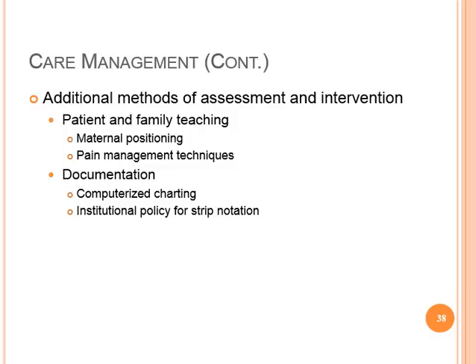It kind of depends. Back in the old days, before we had the computerized system, everything we did to the mom, to the baby, we would chart it on our fetal heart rate tracing and also on our labor flow sheet. So it was almost like a double documentation thing. But with the computerized charting, everything goes right on the computer, and it puts it on the tracing, or it puts it where it needs to go. So it's a big help.